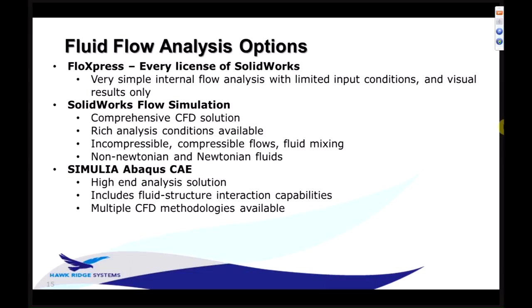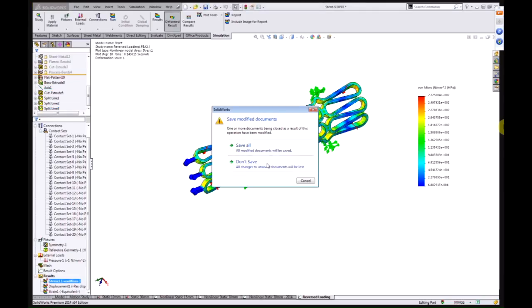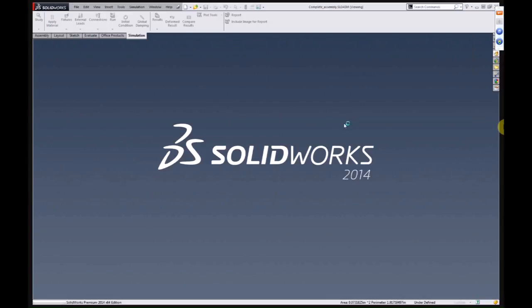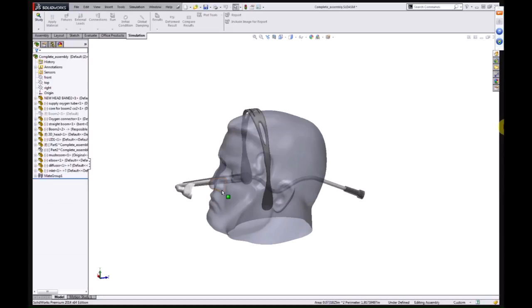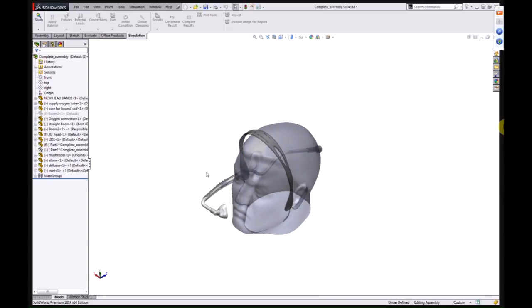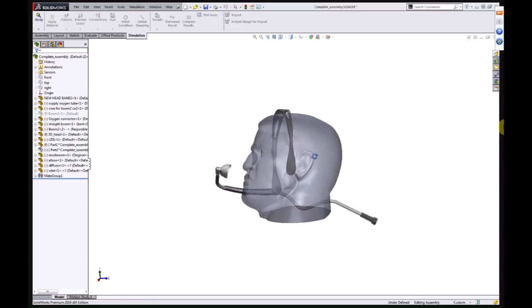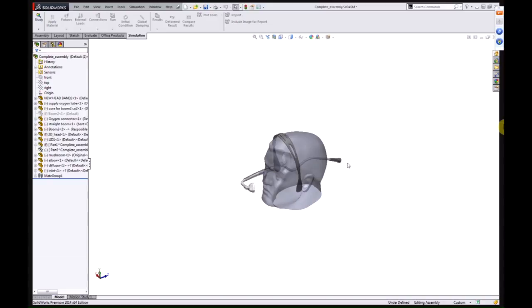So first, the example I wanted to look at here, starting off in SOLIDWORKS Flow Simulation, is a medical device application for a piece of respiratory equipment. It is a tool called the oxy-arm. The idea of an oxy-arm is that for a patient that requires oxygen therapy, the typical mode of application is to put a tube up their nose and connect it to an oxygen source and carry it around all day. The idea of an oxy-arm is that it's less invasive: by providing oxygen through an arm that's worn as a headset, it'll blow it to their nose and mouth. They'll get an appropriate oxygen mix at that location, and it's less invasive than having a nasal cannula or something like that.